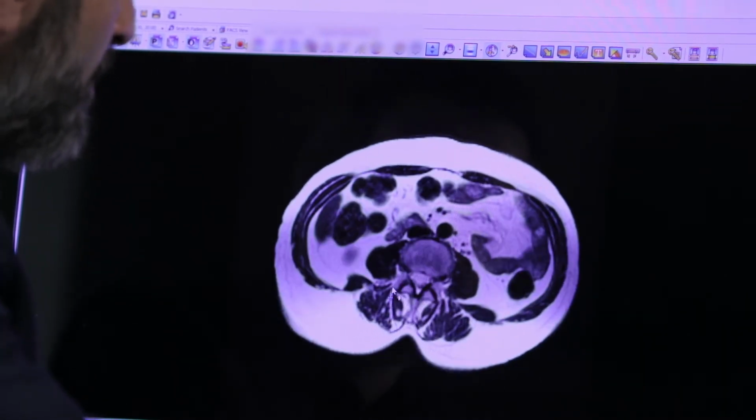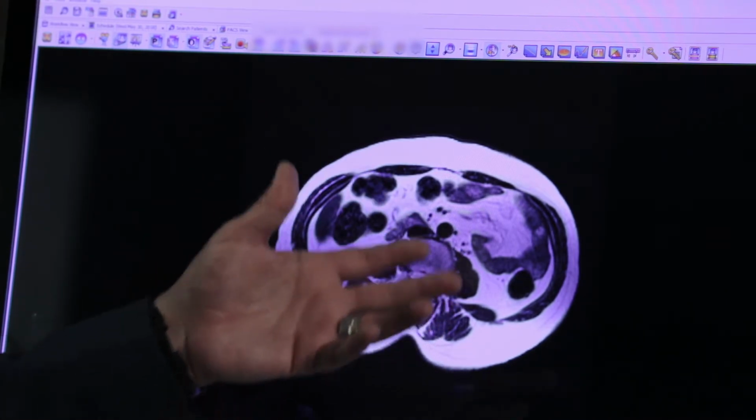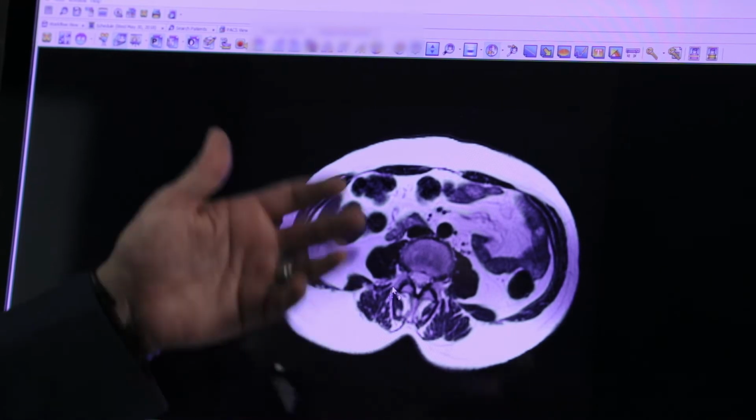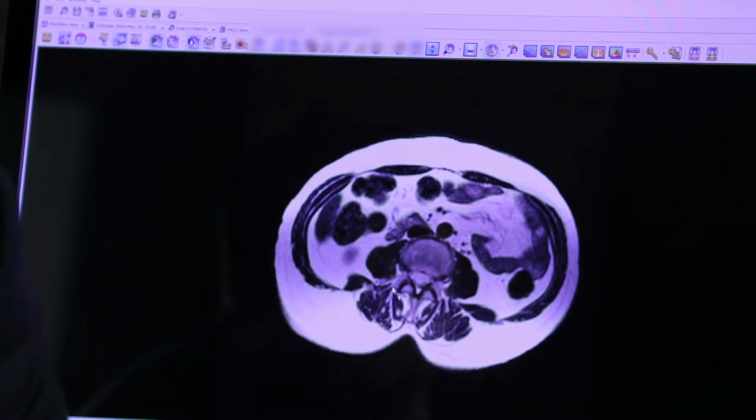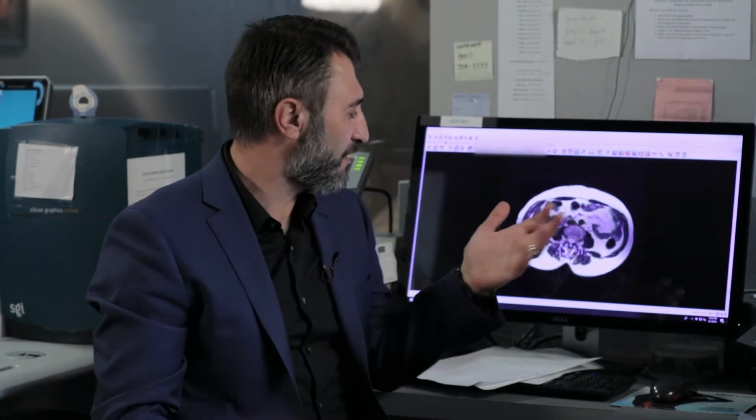So when you do an MRI, one sequence looks at fluid, like I said, and another looks at the bone better. That's the advantage of the MRI. It does take a little bit longer than the other modalities, but it does give you more information as well. And along with ultrasound, MRI is very non-invasive. It doesn't have radiation, so your body's not being harmed by having these studies.